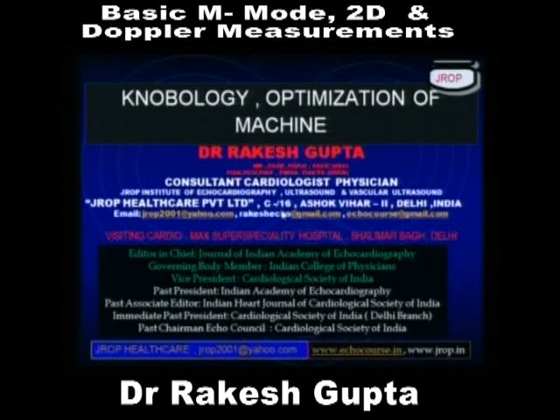What do you mean by color flow imaging? What is color flow? Based on the direction and velocity of blood, a certain color is labeled to it. If the flow is towards the transducer, it's red. If it's away from the transducer, it's blue.